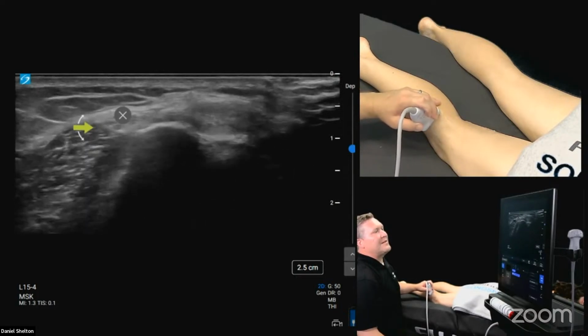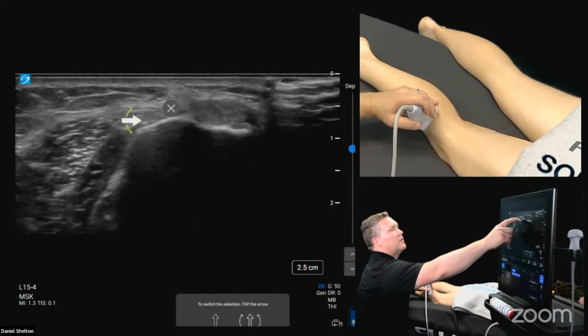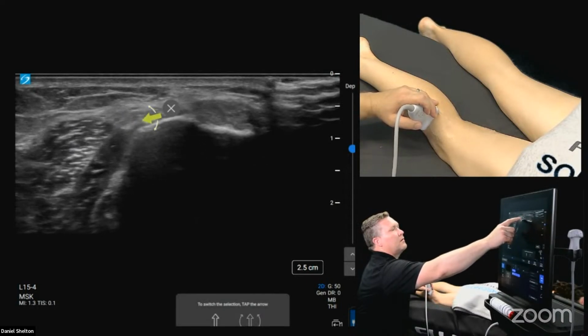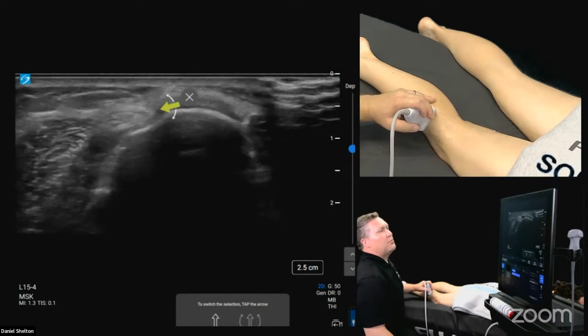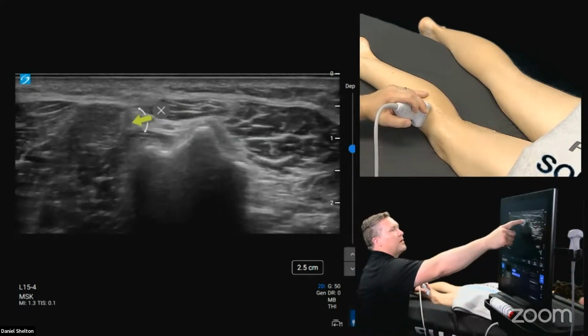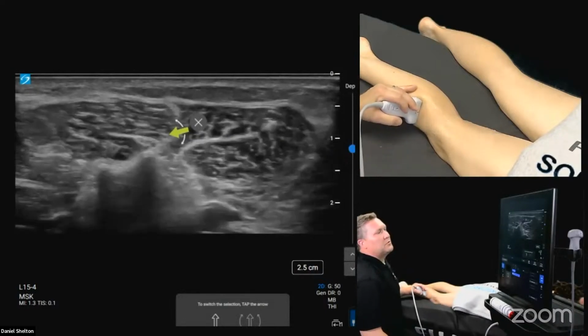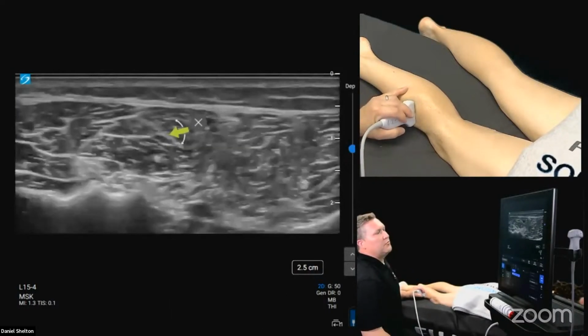Right there, you can see that tight compartment that the nerve sits in. Right here, let's rotate that guy there. Not much room, and that's a common point of entrapment. And here we see it split to its posterior and anterior divisions here, or the deep and superficial. And you can just keep tracing it down.